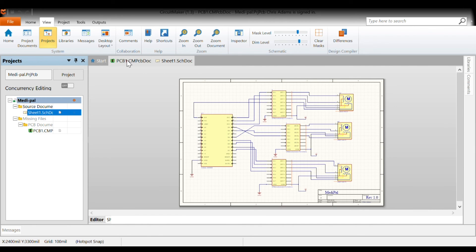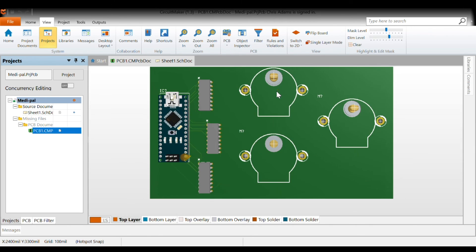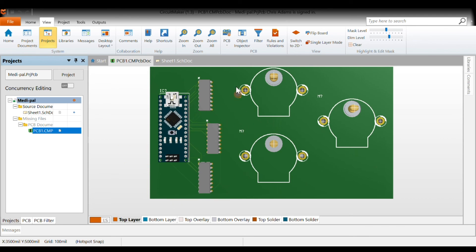If I show the PCB, it really illustrates how compact a design the controller, along with the motor drivers, takes up.